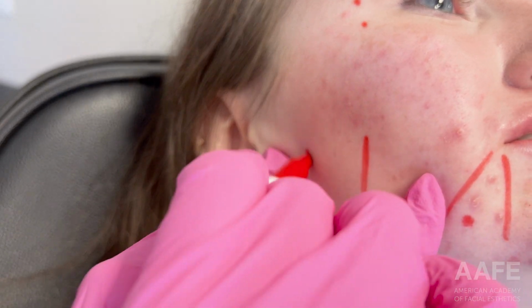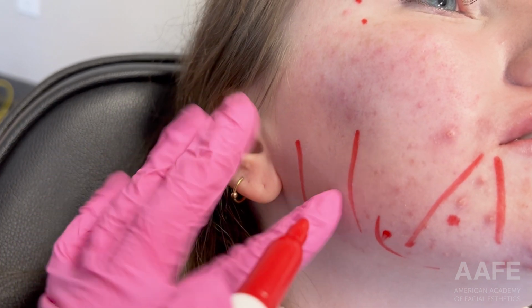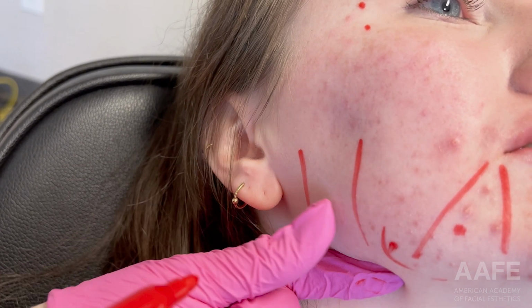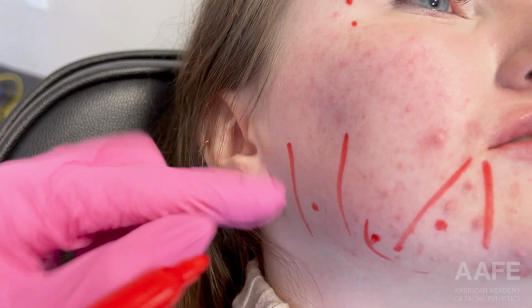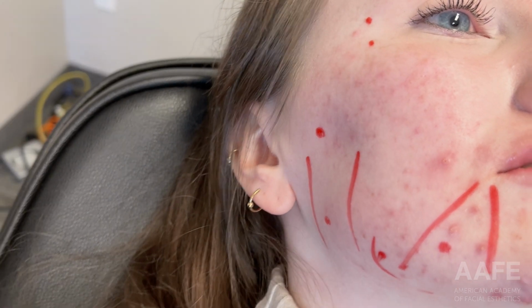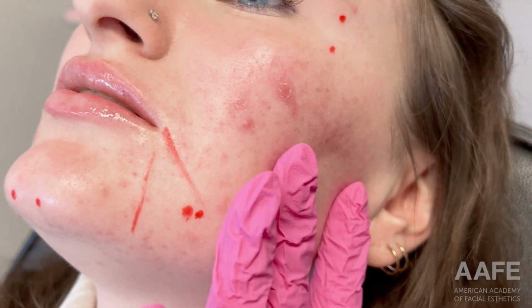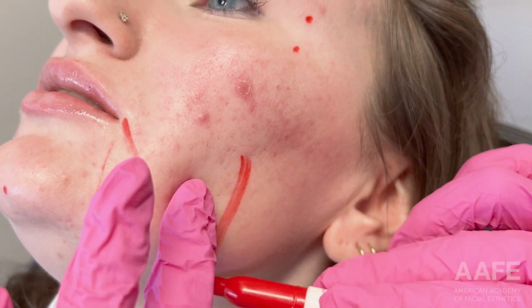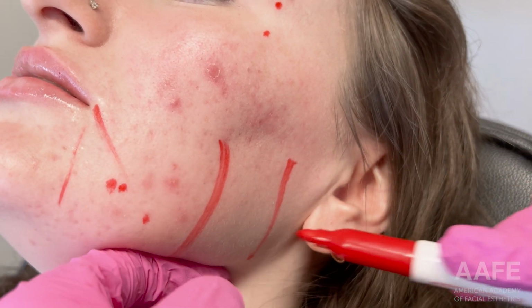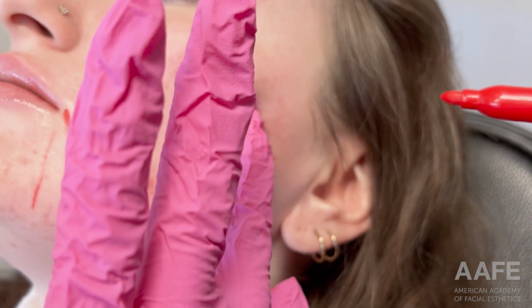You can look at this patient and just tell that she's a clencher, just by how strong she looks. She looks boxy back there, and she is well aware, and she also does clench and grind, she says. I marked her antegonial notch just as a landmark. The anterior border of the masseter will always fall directly into that antegonial notch. I'm feeling the edge of the mandible and going about 1 centimeter up and slightly posterior.